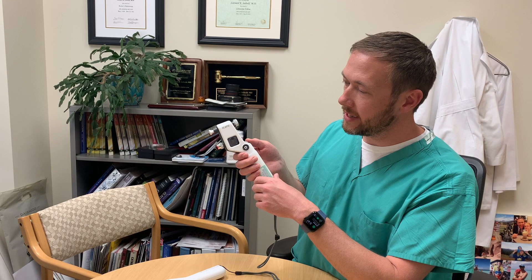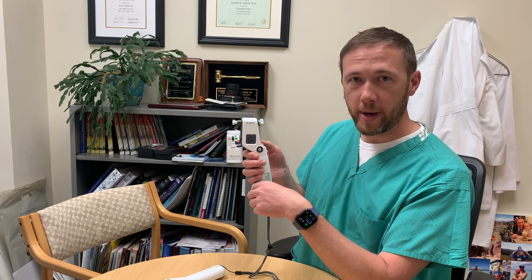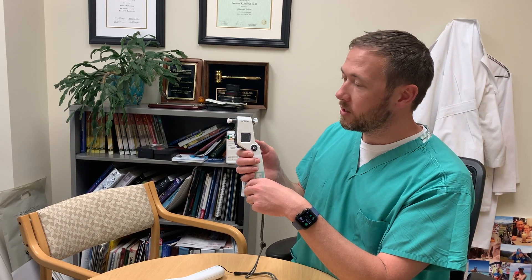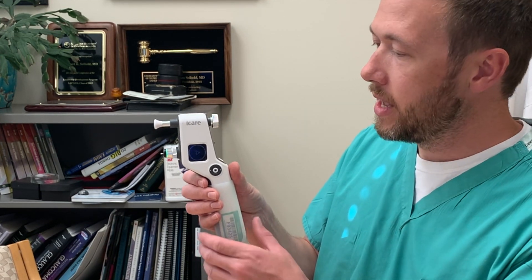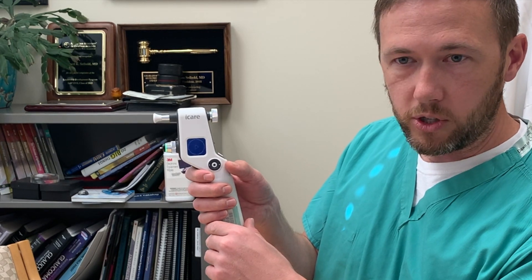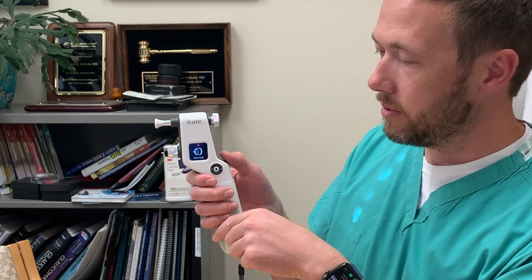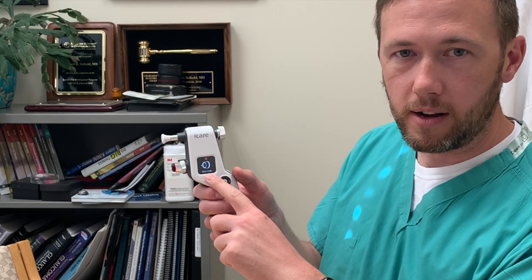If you tilt the device too far down, you'll see the light go red, indicating you can't take a reading. If you're perfectly horizontal, it'll go back green, indicating it's ready to test. And if you tilt up too high, the light will return to red, indicating a reading cannot be made. So with the IC100, keep it nice and horizontal and make sure you have a green light. You'll see a play button flashing on the screen, indicating you're ready to take a measurement. It takes a series of six readings, which you can take one at a time by pushing the play button — you'll see the probe pulse out each time — or you can hold it down and it'll take six rapid readings in succession and give you an average reading.